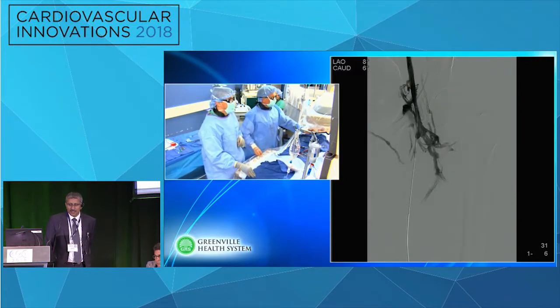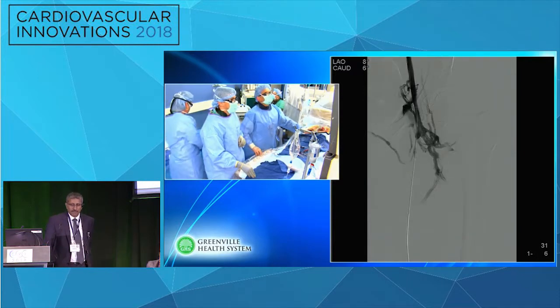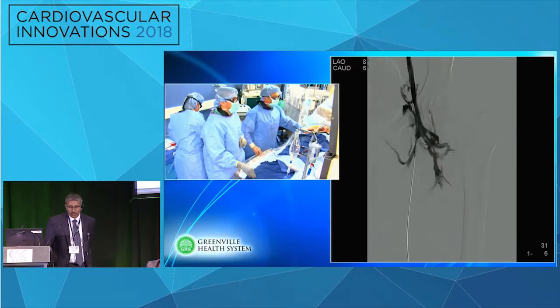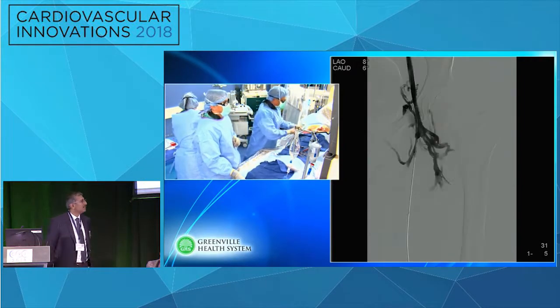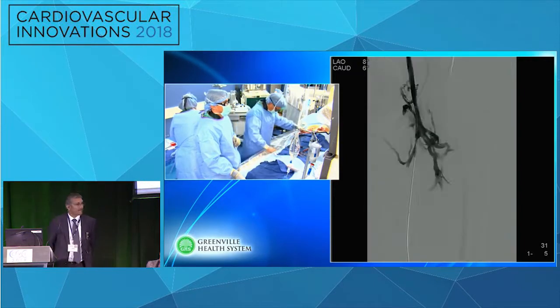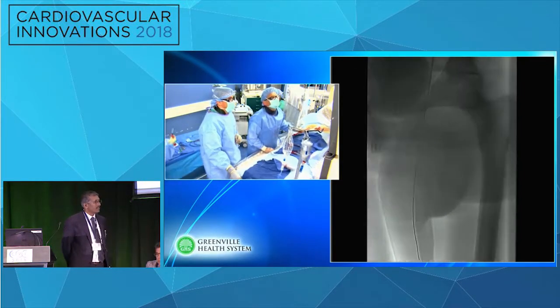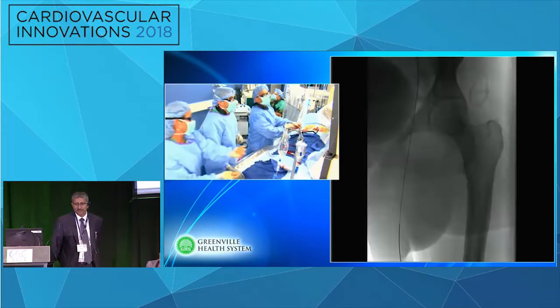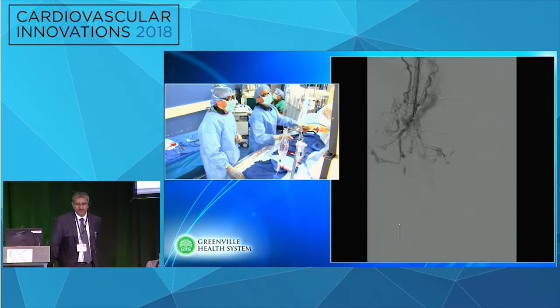I think there's a recoil there, so maybe repeat ballooning gently. I think there's a recoil there, so maybe it's low pressure, prolonged, gentle ballooning again. Anyone? We have a few minutes left. Let me get a little different picture here. Okay. Peter, would you balloon again here, or because you just lost flow? I think it's just going to keep recoiling on you.